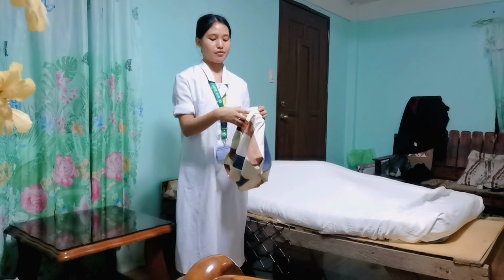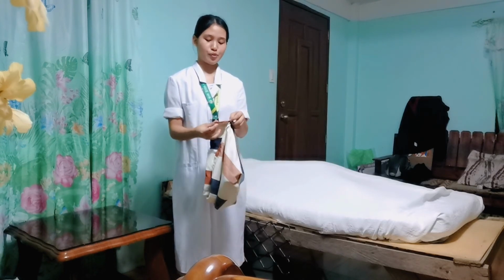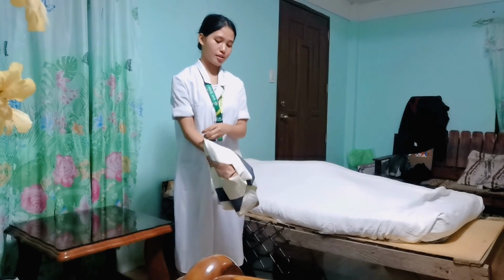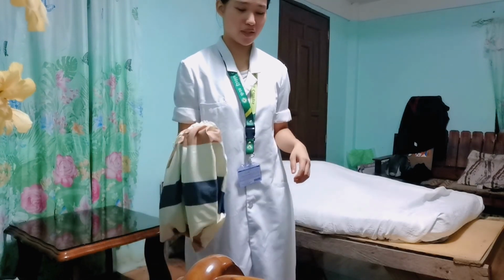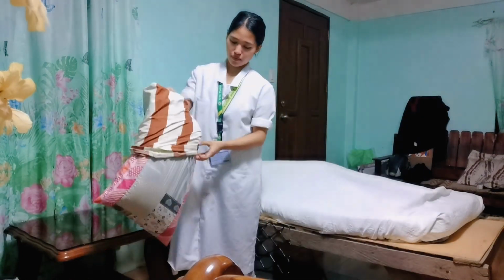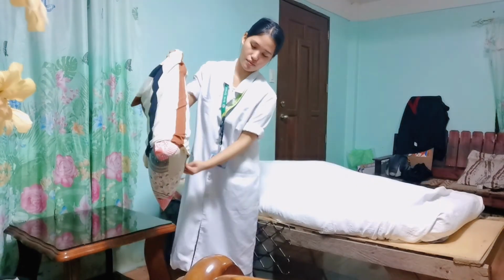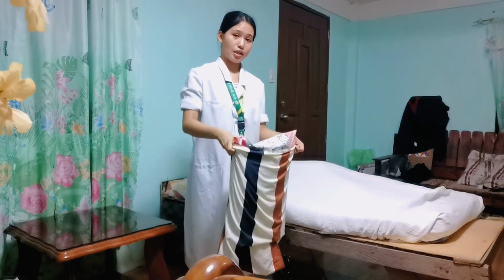And then we will be inverting this edge by putting our hand and inverting it under and then grab the pillow. Remember, do not shake the pillow.